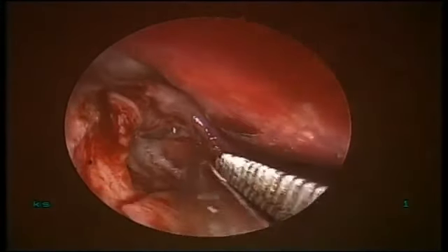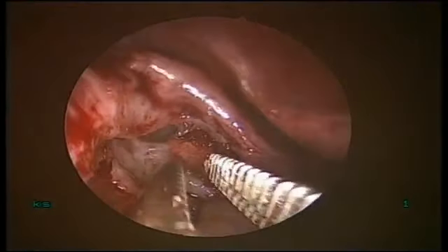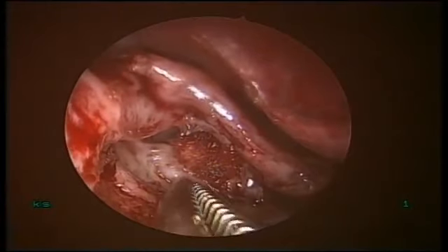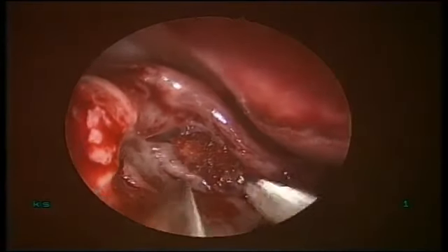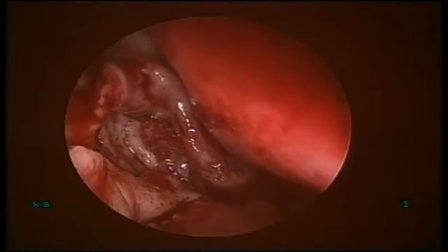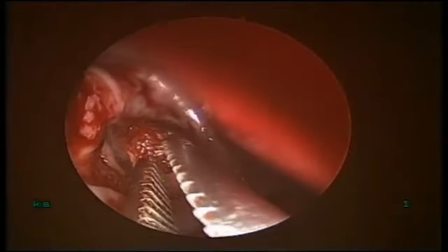Yes, this one settles down with the blood. See that? Yes, sir. Since the posterior surface, both raw areas are in contact, the outer side of the sac and the bone underneath. If they remain in place for a day or two, the adhesion forms.